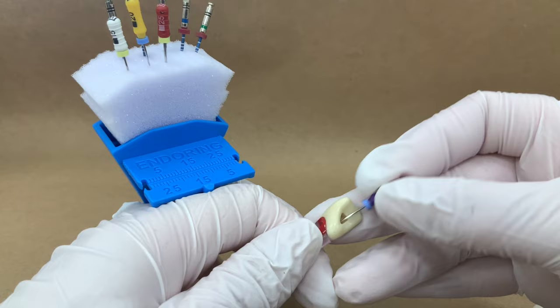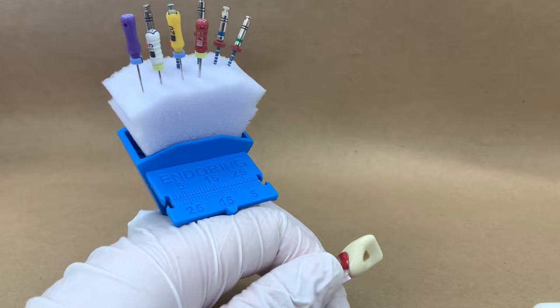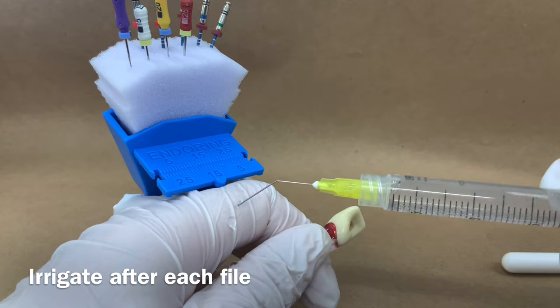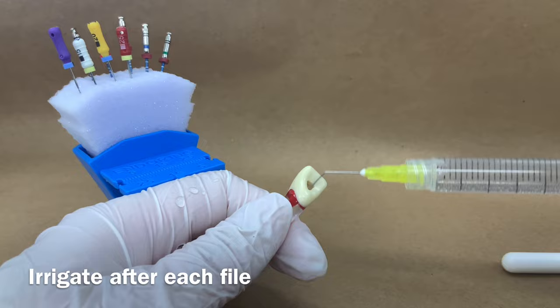The file should be used until it has minimal binding or resistance within the canal. Remember to irrigate after each file. This prevents the debris from getting pushed and compacted towards the apex, which will block the canal and prevent you from maintaining apical patency.